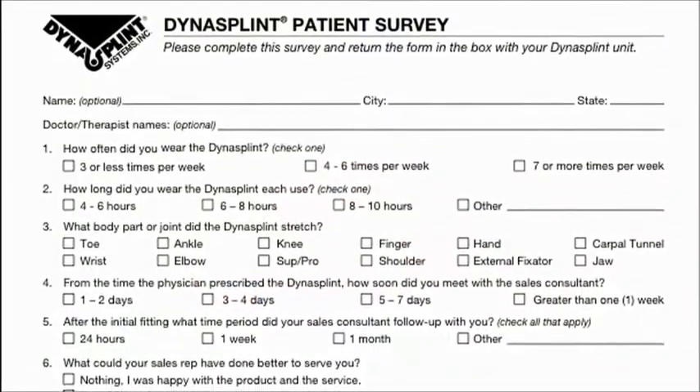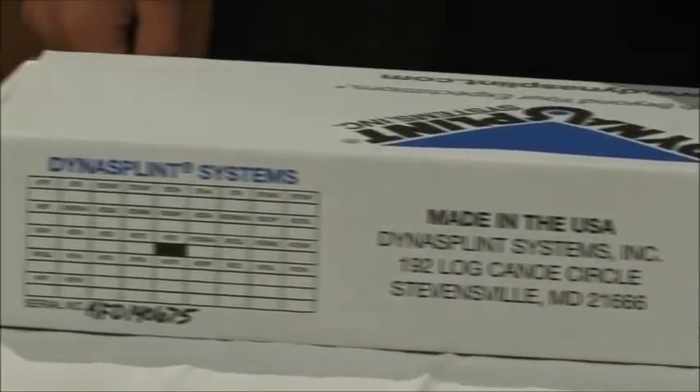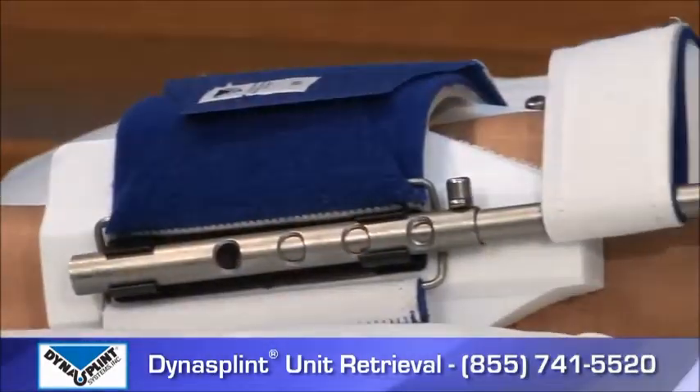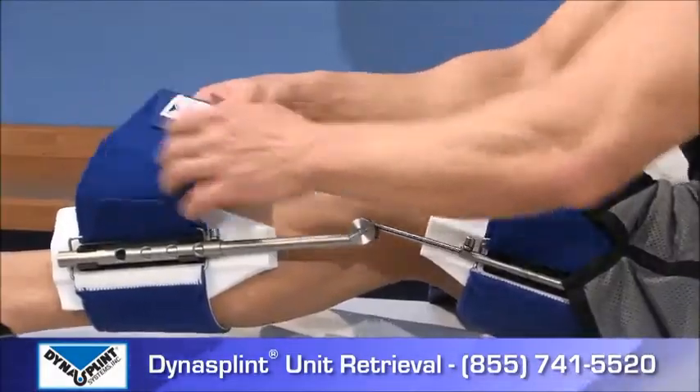Place the splint, pads, and all adjustment tools inside the box. Please fill out the patient survey and place it in the box. Close the box and seal it with a strip of tape.